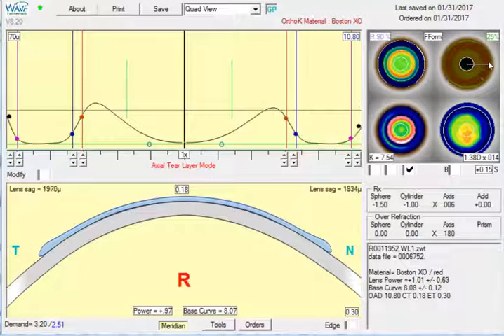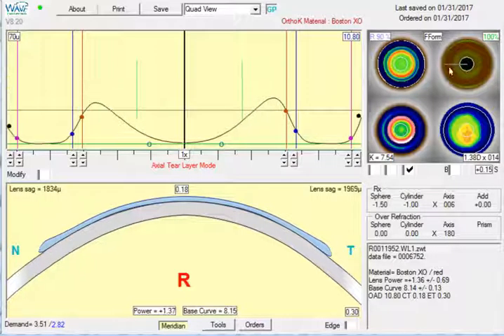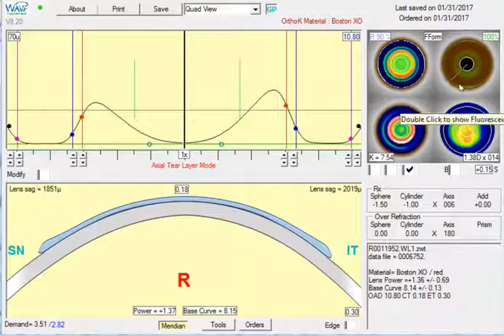Okay. However, our topo demand is a little bit low now, so I'm going to go back to 100%, and we'll bump this up a little bit. Okay, so 3.5 is pretty close to original. One more time, I'm going to just spin around here and make sure we're pretty uniform, and this does look pretty good.